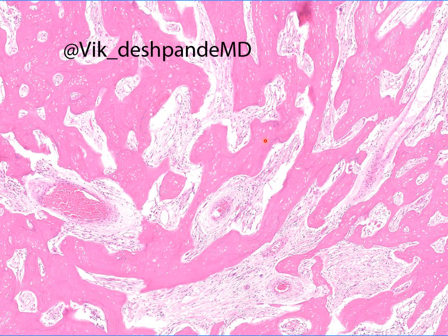This is what a parosteal osteosarcoma looks like in the interior of the lesion: broad, thick seams of bone surrounded by relatively hypocellular stroma. The nuclei on most of these seams of bone are dropped out because of over-decalcification. You're probably asking yourself, where are the neoplastic cells? They're here — just very few, and they are hard to see.